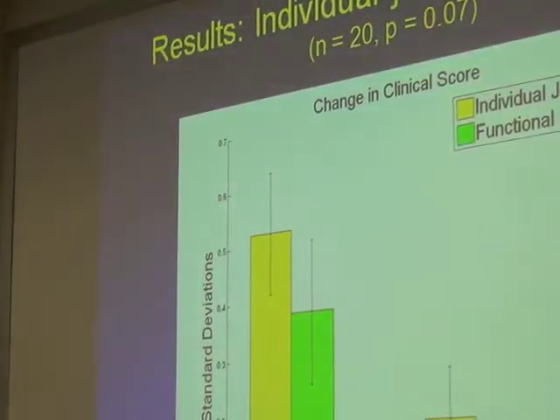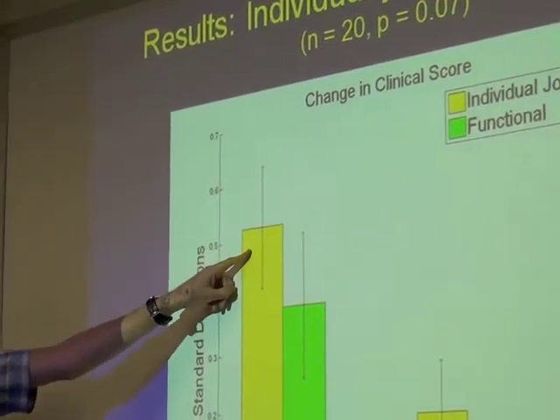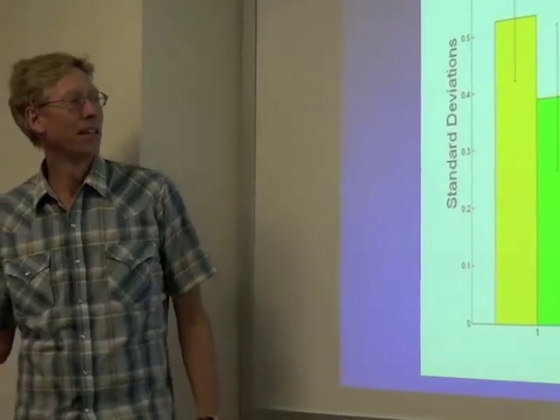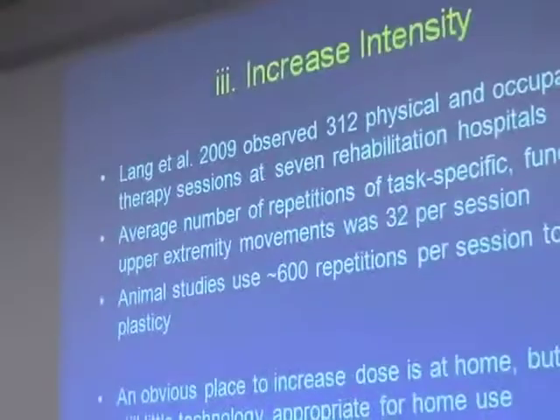And much to our surprise, this is kind of a summary measurement, but they got better when they did these individual missions. So it's really counterintuitive. It borders on statistical significance, so you have to take that with a grain of salt. But that was fascinating to us. So again, physical therapy, rehabilitation therapy, has this mantra, but it's really not been proven, and now you have a device that can test it, so you can do science with it. Okay, so simple devices might be okay.